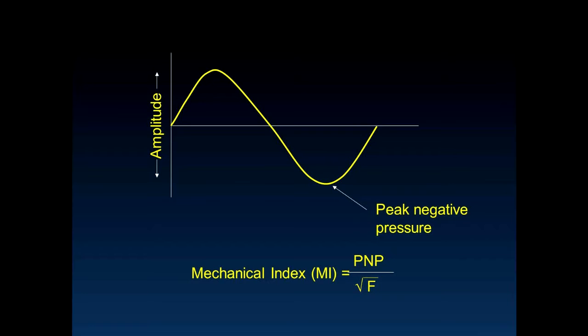If the ultrasound crystal is excited to a greater degree, an ultrasound wave with a larger amplitude and a larger peak negative pressure and greater acoustic energy will be produced. Thus, the mechanical index of ultrasound is directly proportional to the peak negative pressure.